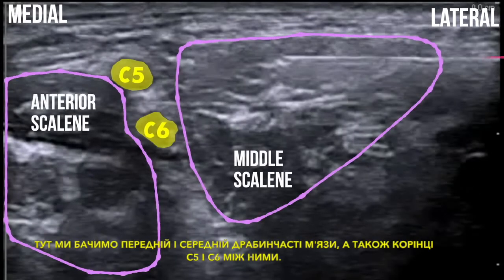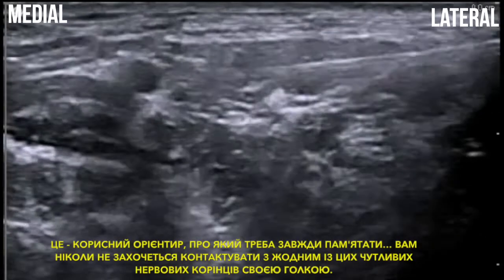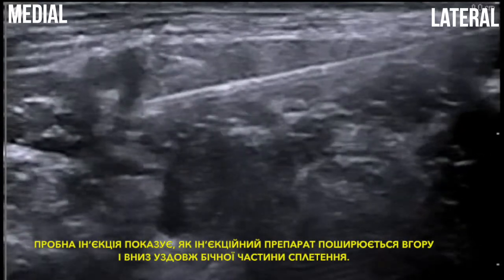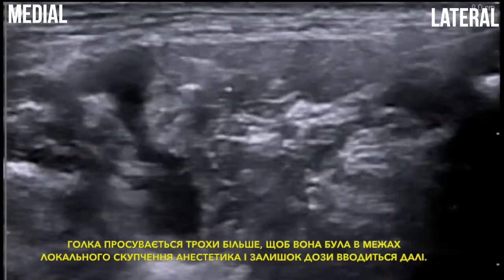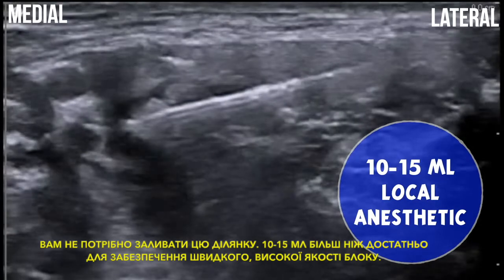Okay, so let's look at this in real time. Here we see the anterior and middle scalene muscles and the C5 and C6 roots between them. The needle is coming across the screen from the lateral side. Note the space between the C5 and C6. This is a useful target to aim for. You don't ever want to contact either of these sensitive nerve roots with your needle. As the needle passes through the fascial covering of the middle scalene muscle, you may feel a small give. A test injection shows the injectate spreading up and down along the side of the plexus. The needle is advanced a little more so it's within the puddle of local and the remainder of the dose injected. You don't have to flood this area. 10 to 15 mLs are more than enough to ensure a quick onset, high quality block.